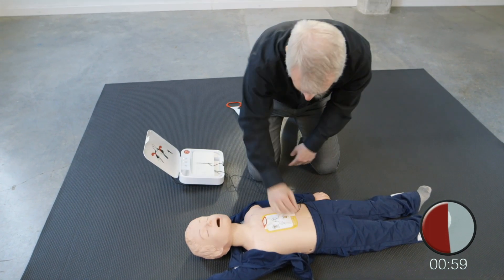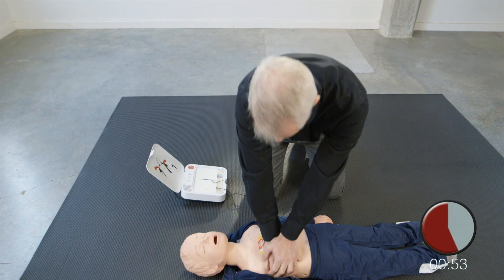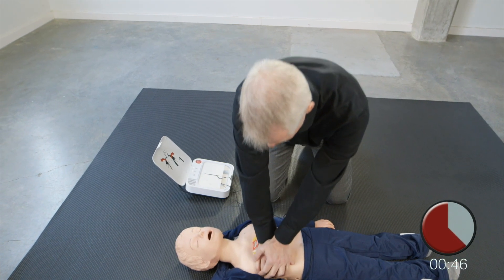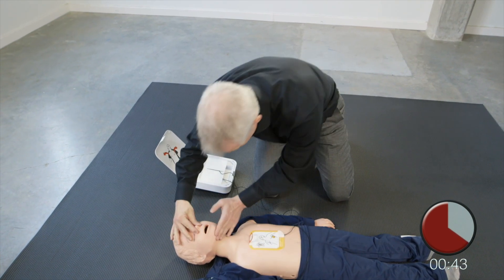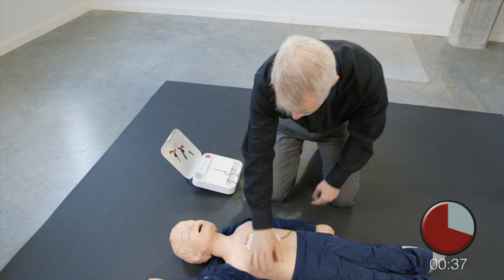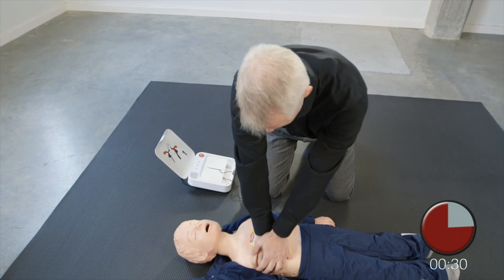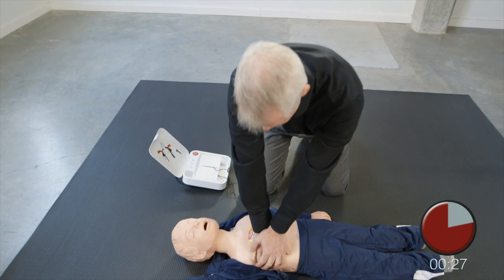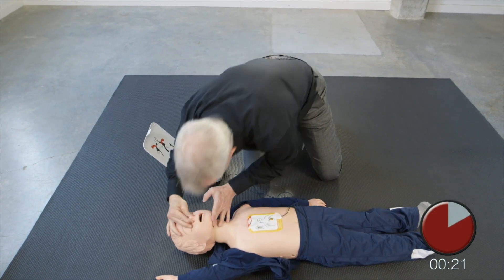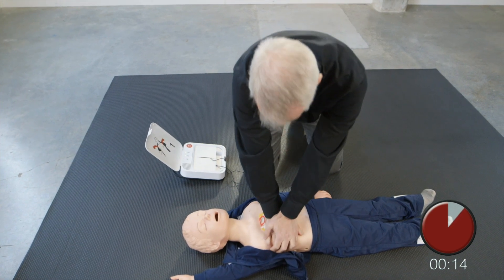Resume chest compressions. Push down deep. Resume chest compressions. Push down deep. Provide two breaths. Resume chest compressions. Push down deep.